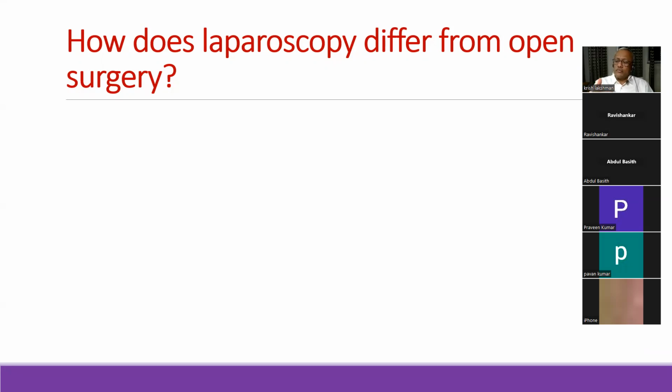You think you're going somewhere, when you're clipping a cystic duct, for example, I give you a clip to clip it, and you really can't get on either side of the cystic duct, which I'm sure every one of us has experienced when we go in. So depth of vision is lost in monocular vision. Yeah, there are also limitations about color perception and hue, but they're not clinically very significant.